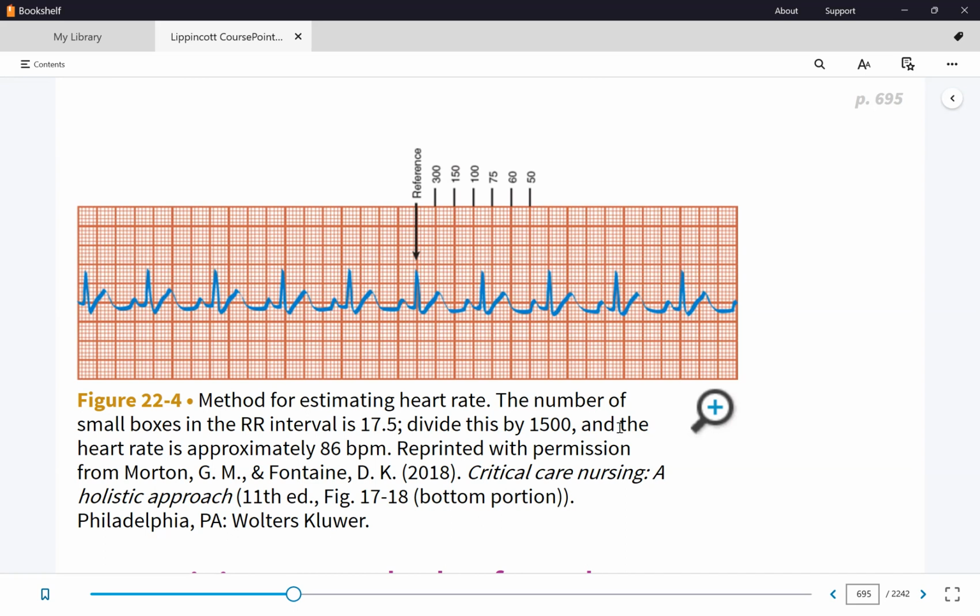All right, so for the exam, what do I put on the choices again? If it's a heart rate question, I'll give you a range. I'll give you, what is the heart rate here, estimated heart rate. Is it 80 to 90, 90 to 100, 100 to 110, or 60 to 70? What will you choose? 80 to 90.